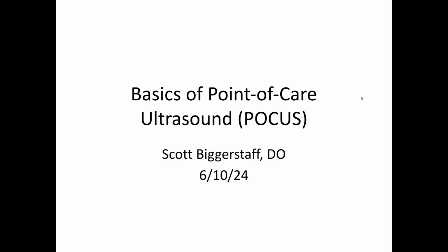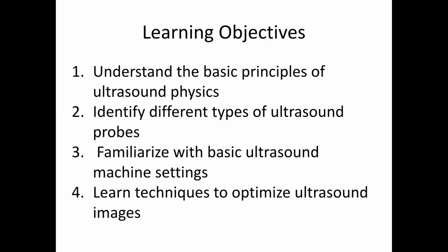Hey, I'm Scott. I'm the director of point of care ultrasound education for the internal medicine residents, and we're going to go over some basics today. Here are your objectives. We're going to learn some stuff about the physics and the probes, and two of the settings.